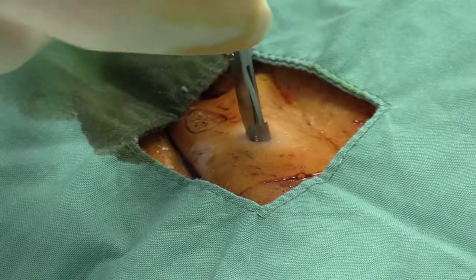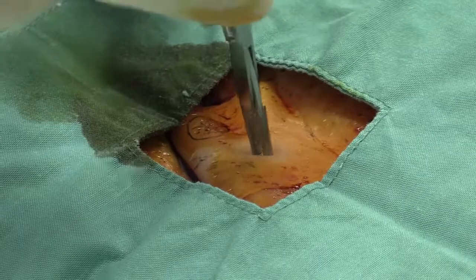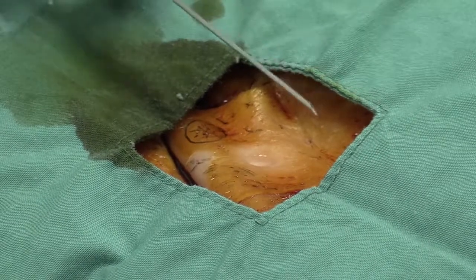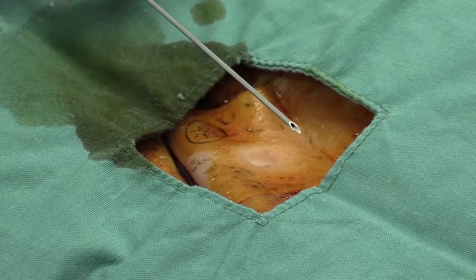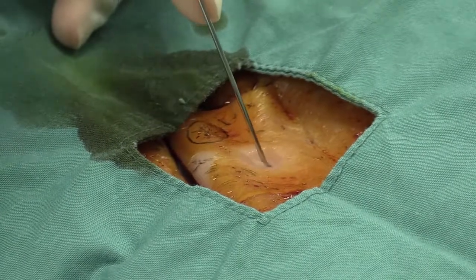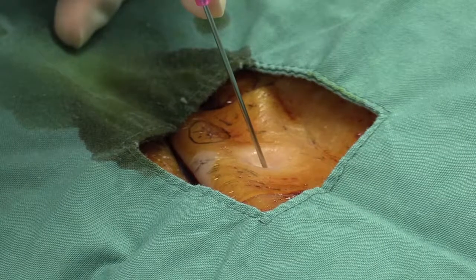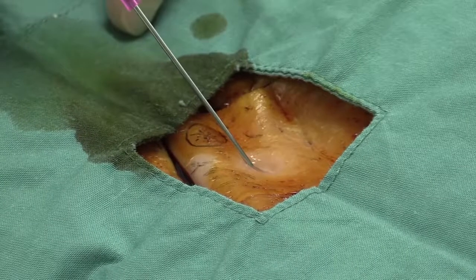Once this point has been reached, the blunt dissection is stopped. This is the needle and the syringe that you'll be getting in the packs. It's a fairly standard insertion needle that is wide enough to accept the guide wire through the center of it. Now the insertion technique is to introduce the needle into the wound that you've created, allow the needle tip to bounce on the fascia of the linea alba, and then aim the needle inferiorly towards the coccyx.